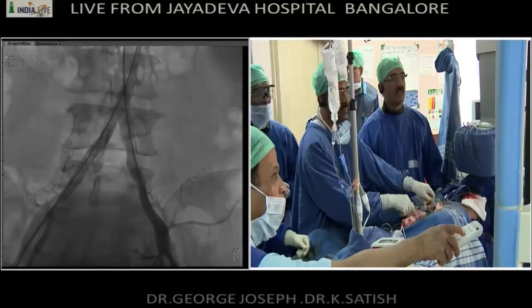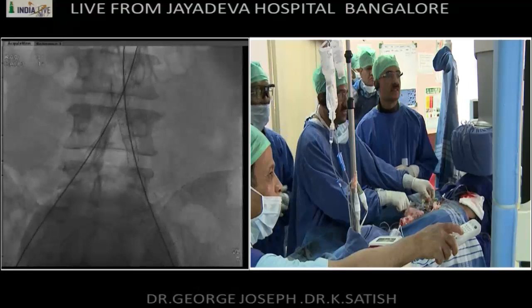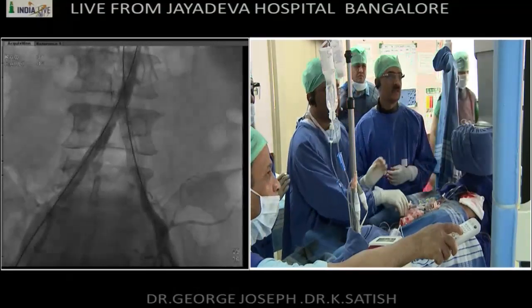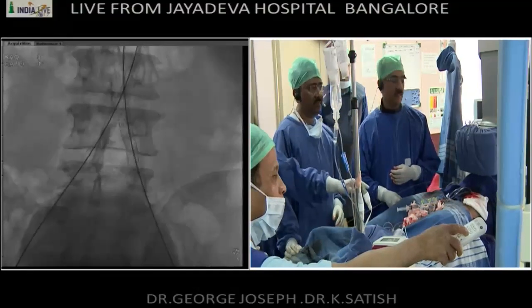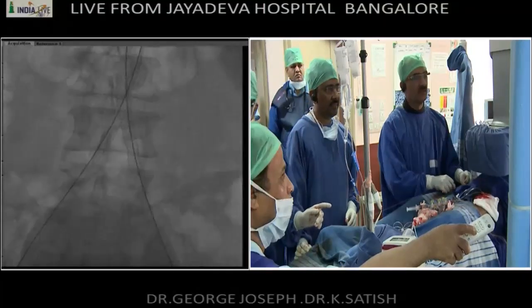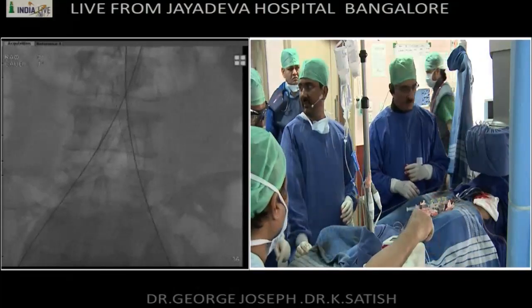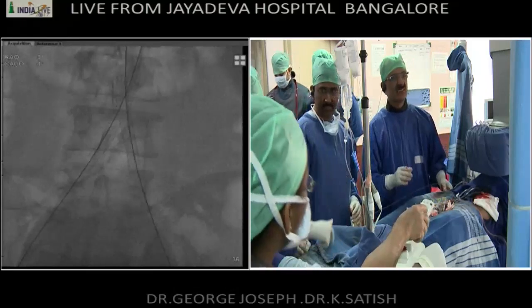We will do a better angio with a pigtail, but right now on this side, it seems like there is a diffuse spasm of the external iliac artery. Okay, that may be true. We can give some nitro. And on the right side, sir, the distal reformation was just at the bifurcation. Yes, the disease on the right was almost till the bifurcation. We have covered only higher up.